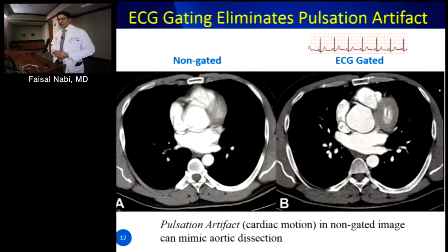Now, sometimes it's not gated. From my experience, one, they're very uncomfortable with the EKG rhythms, and number two, they feel that it increases radiation dose, and that they're very comfortable reading around these artifacts. They recognize that. But when it comes to serially following measurements, you really have to gate. And there have no doubt been cases where people have been referred to this institution with dissection, and the study's ungated.